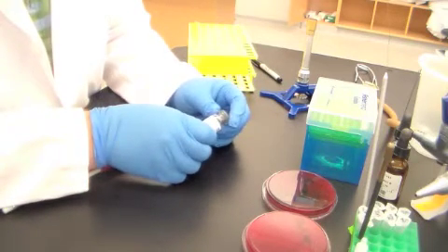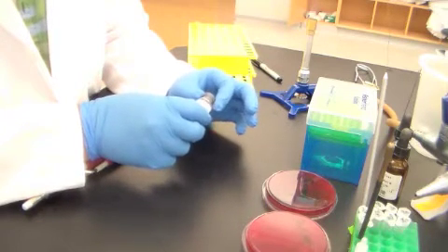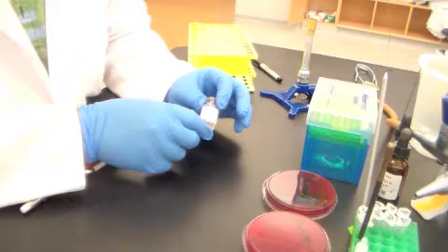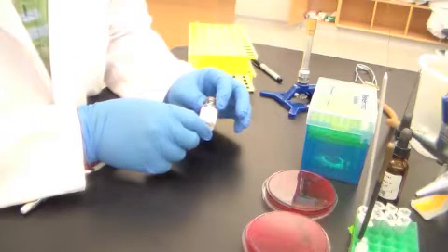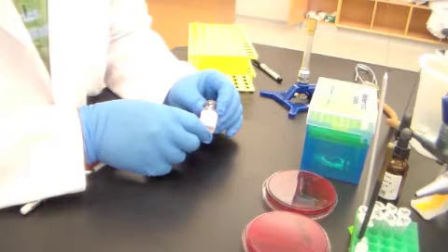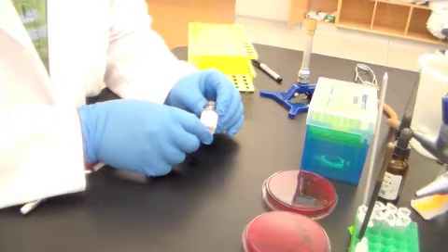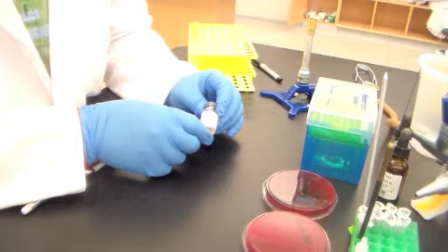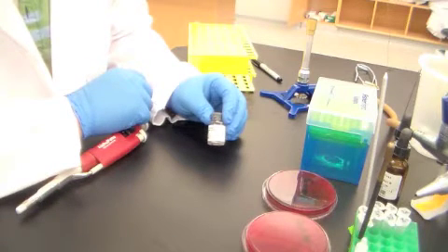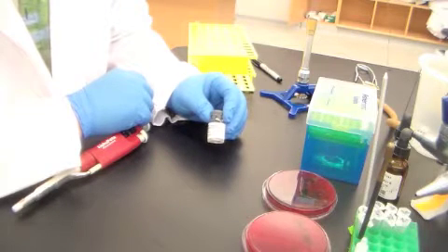This test is done using rabbit plasma. I've reconstituted a lot, and the TAs have reconstituted even more of this rabbit plasma. The difference between plasma and serum is an important distinction. When blood is drawn by venipuncture into an anticoagulant, such as sodium citrate or more likely heparin, the blood doesn't coagulate. It stays in the fluid phase. At that point, you can separate the cellular component from the fluid component by centrifugation. The fluid component from that uncoagulated blood is referred to as plasma. That is, in fact, the fluid phase of all of our blood.